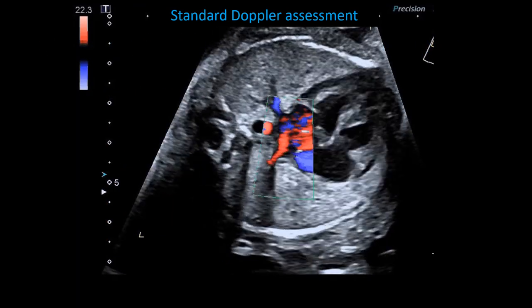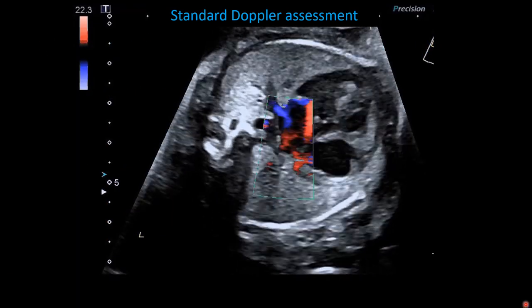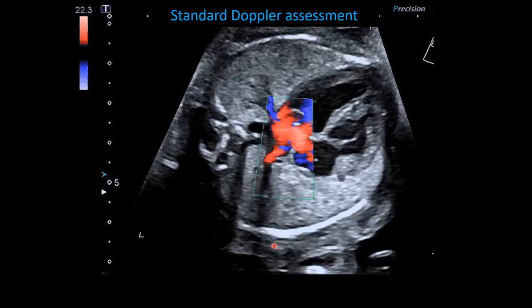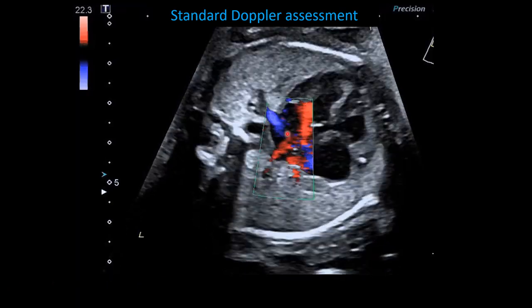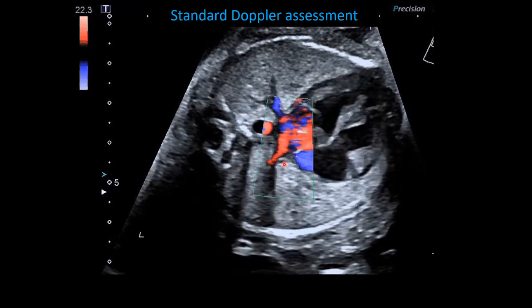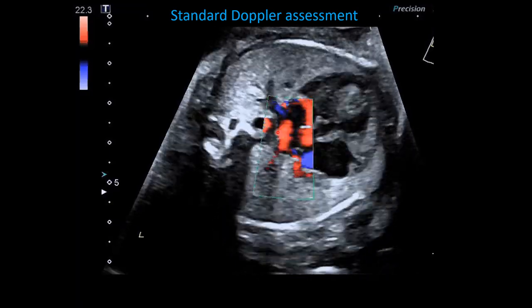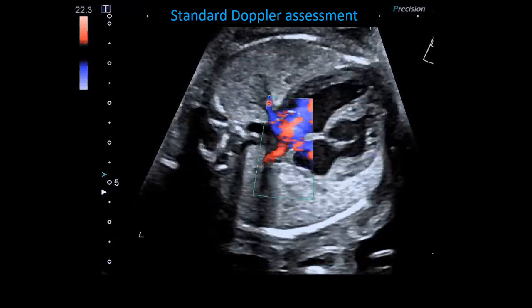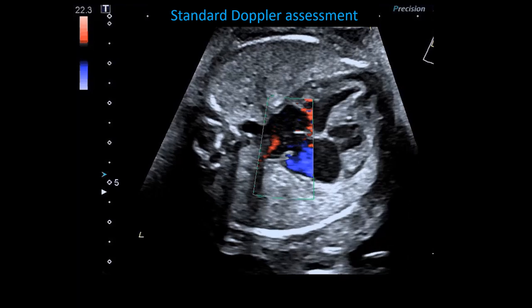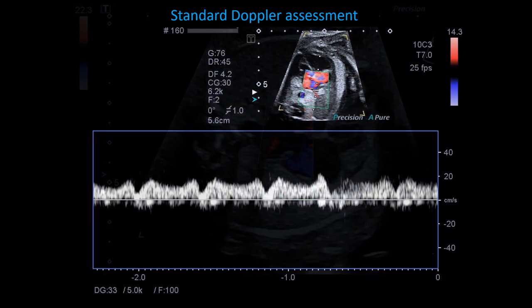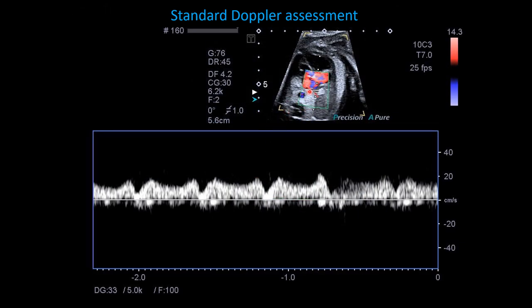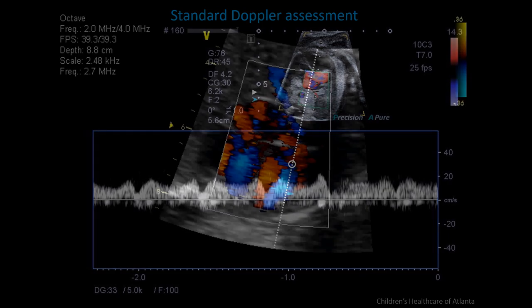After performing our initial fetal presentation and lie assessment, we start in the four-chamber view looking at the pulmonary veins — the right pulmonary veins with color Doppler, then the left pulmonary vein — and we evaluate these with spectral Doppler. In each pulmonary vein, we try to align as parallel as possible with the plane of insonation. This is a normal pulmonary venous tracing.